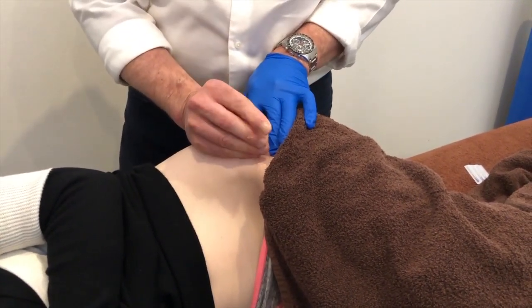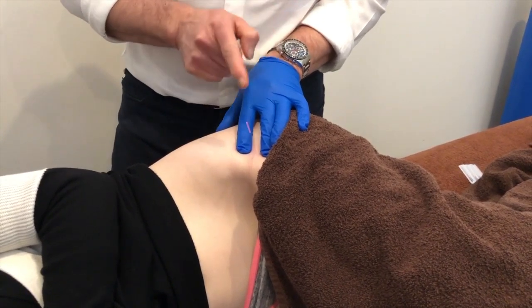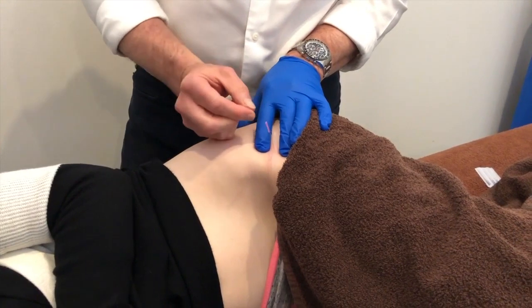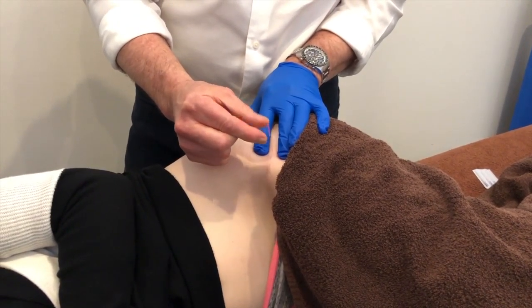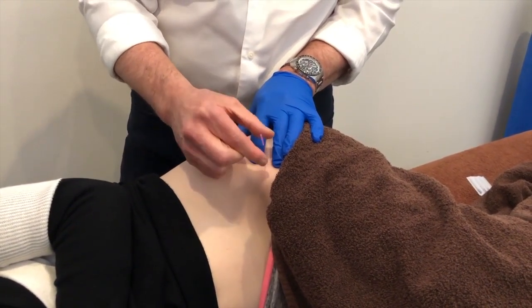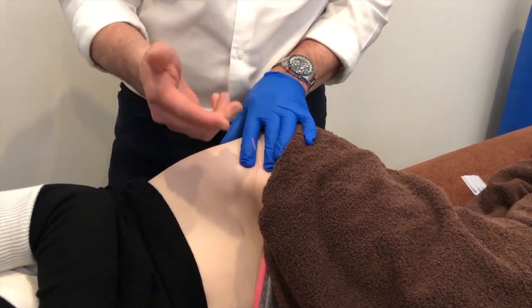Now, let's say that we're having trouble getting, see that bolt upright, not gonna go anywhere. So, as we move that needle in, let's say that needle starts wobbling. We got it like this, and it starts wobbling like this. Problem with that is that you're now at 90 degrees to the handle. That means half of your force is going through the handle, and then the shaft, the rest of it isn't.